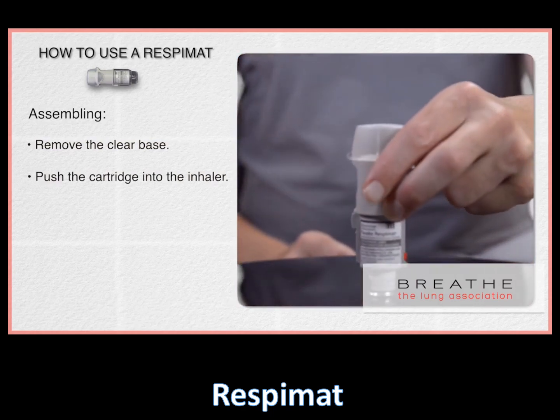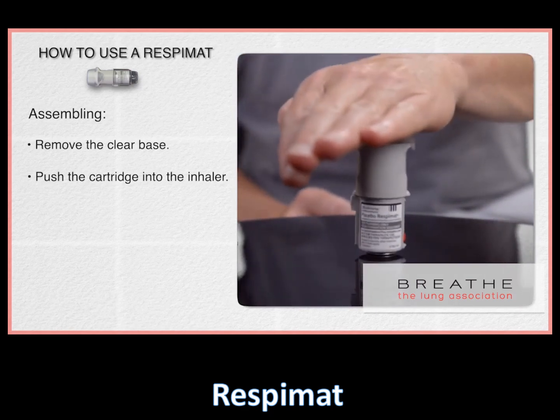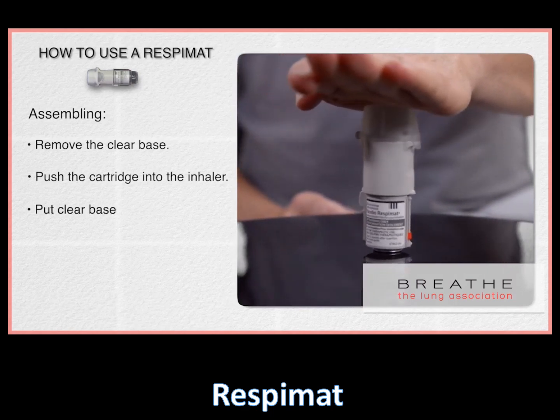Place the inhaler upright on a firm surface and push firmly down on the inhaler to ensure the cartridge has gone all the way in. Put the clear base back into place.